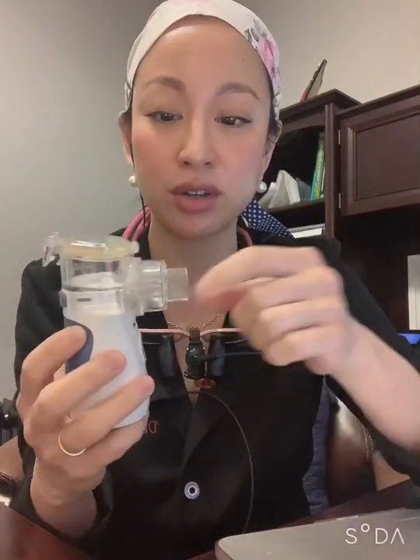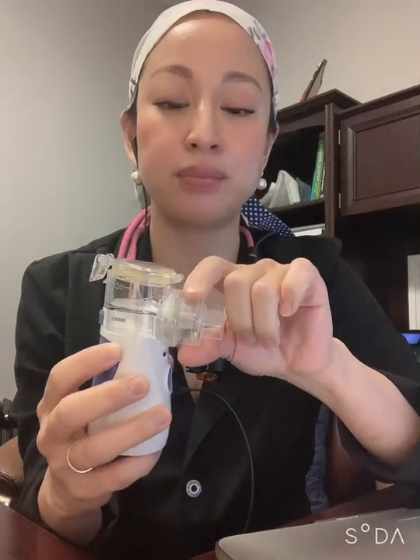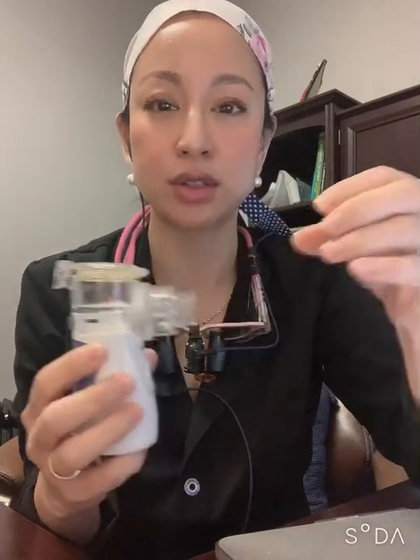We can be more specific. If you have condensation developing around the mask and it's leading to leakage in the water droplets or any kind of your solution droplets, maybe there's leakage around the seam of the mesh and into the chamber where the mist comes through.